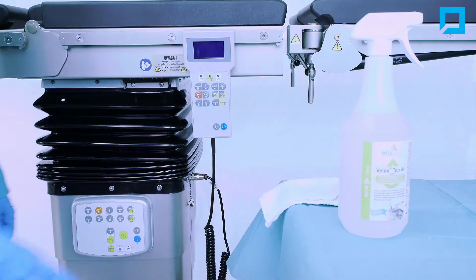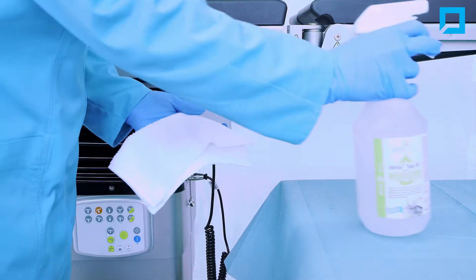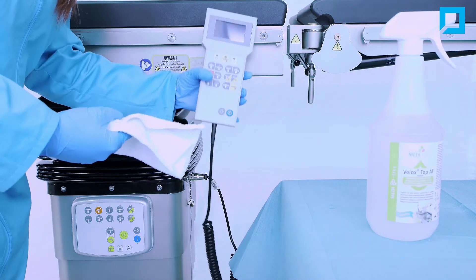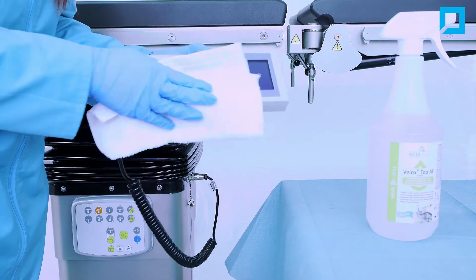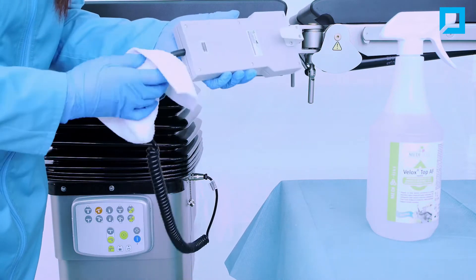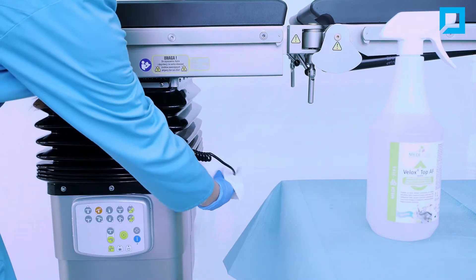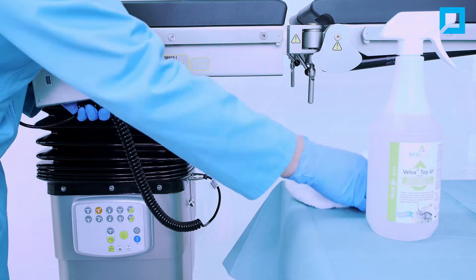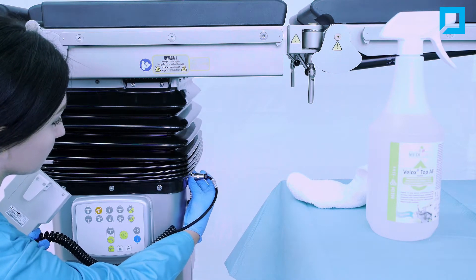The pots cannot touch the floor. Disinfect the remote control with disinfecting liquid or alcohol wipes. Unlock the remote control from the table.